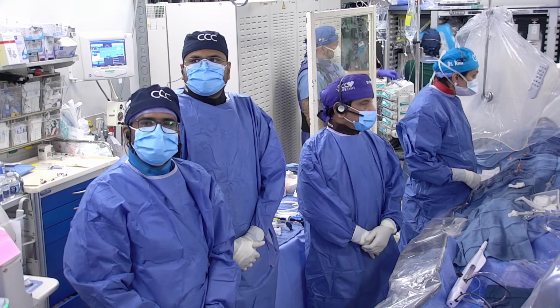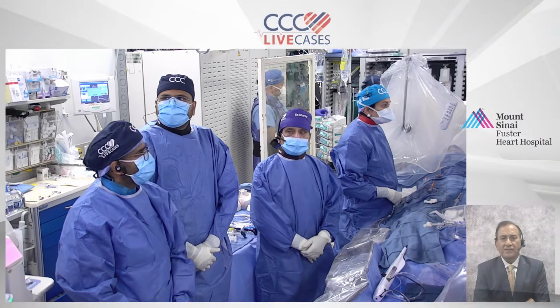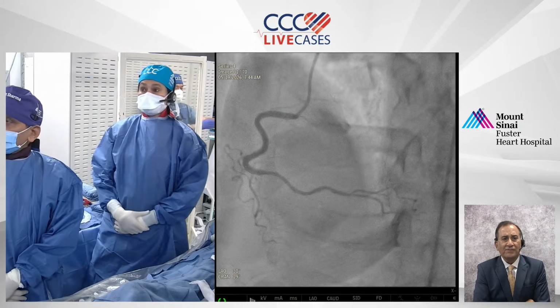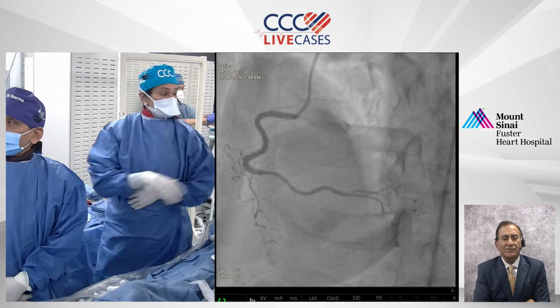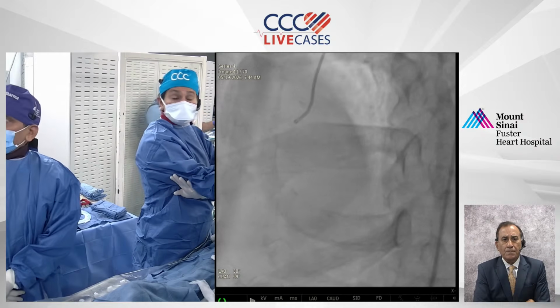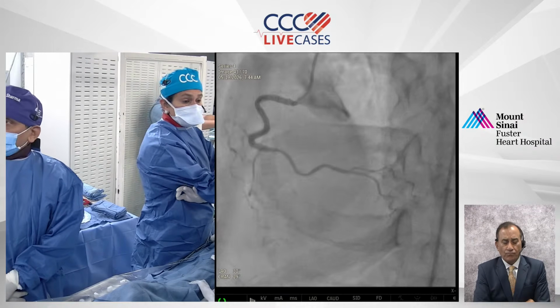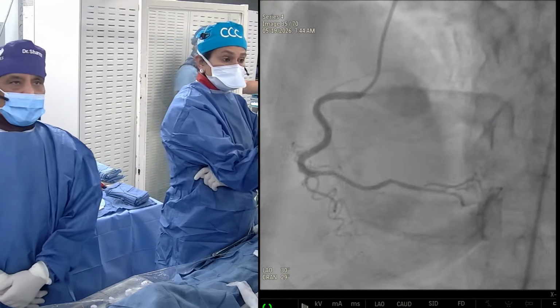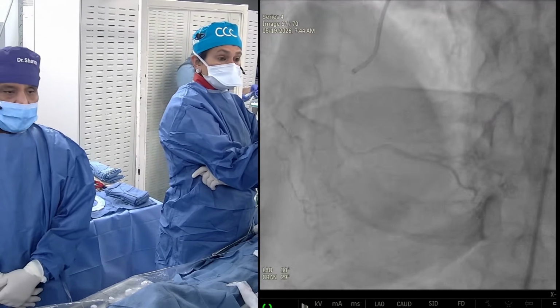This case truly complements the left main from last time when we were dealing with the diseased left circumflex as well. That time we did the imaging and it was not significant. In the end it looks a little hazy, but there was good blood flow because there was some left main dissection. We left that alone.